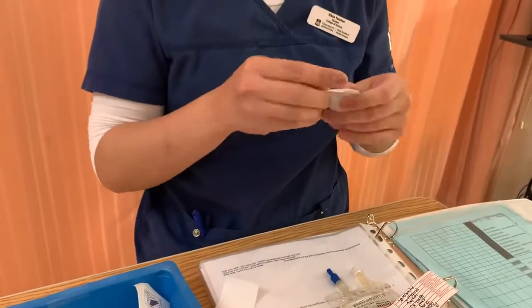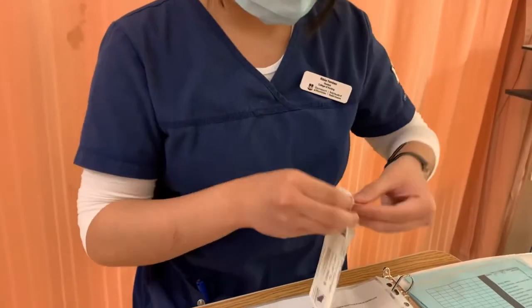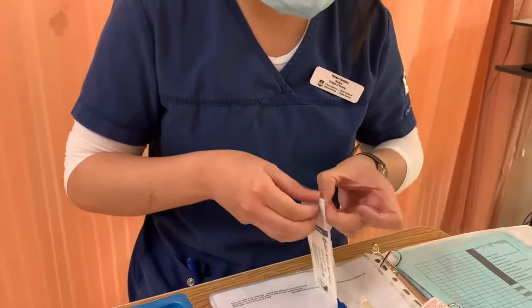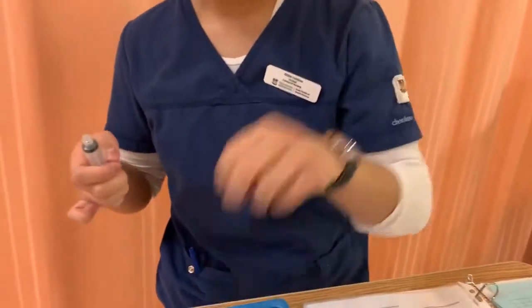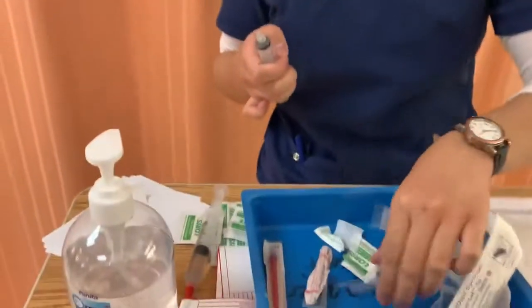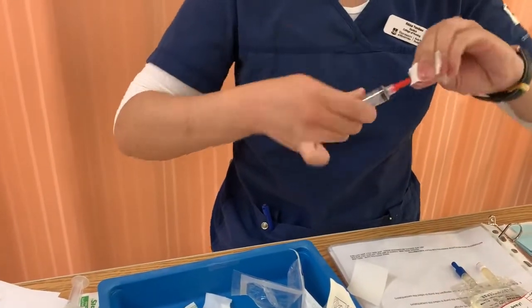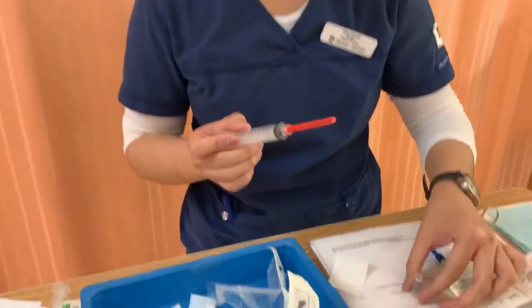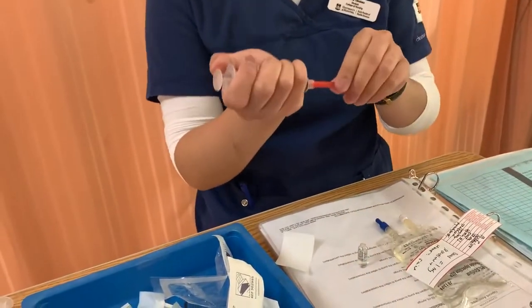So we have our syringe right here. How much time? 15 minutes and a half. Okay, so I'm just gonna open this up while maintaining sterility as well. There we go. For demo purposes, I'm gonna use a blunt fill needle, but in reality, we will be using a filter needle. We had trouble with the blunt fill filter needle before in the demo, so we're just gonna use a regular blunt fill instead of a filtered one.